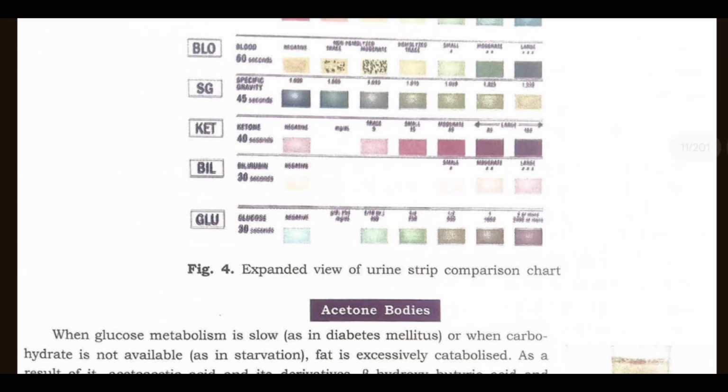Expanded view of urine strip comparison chart. अब आते हैं एसीटोन बॉडीज पे.